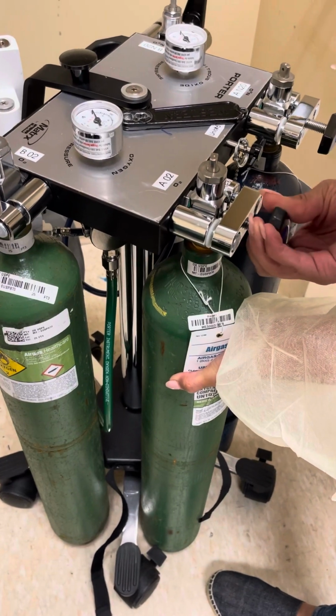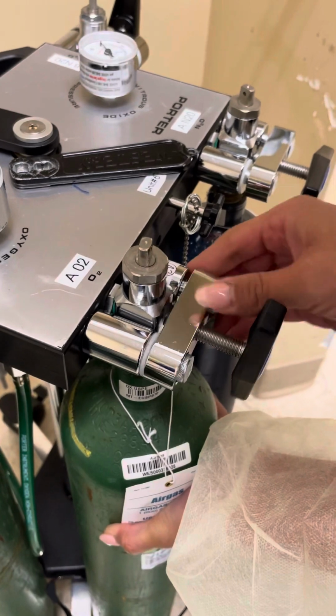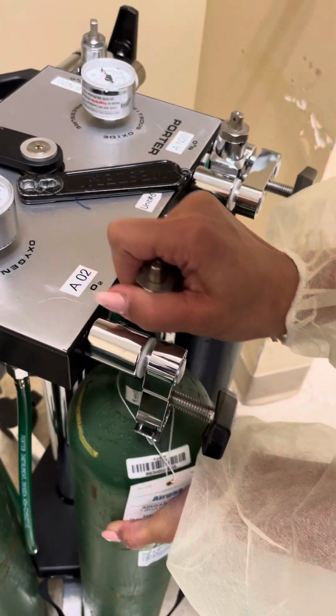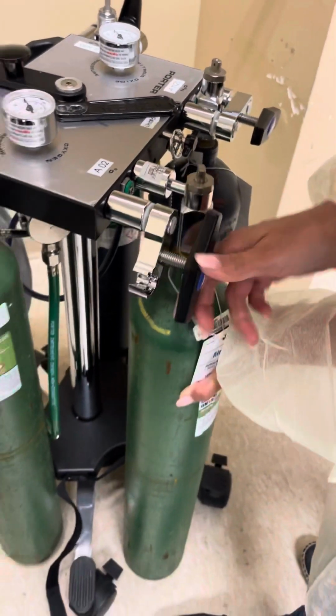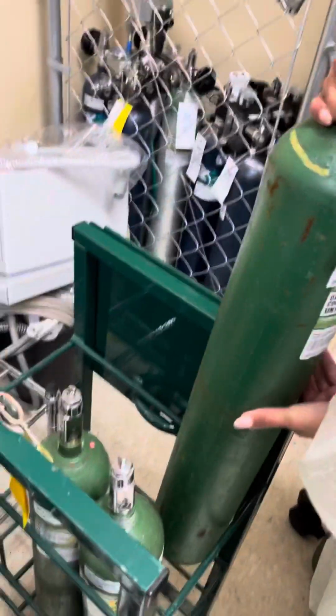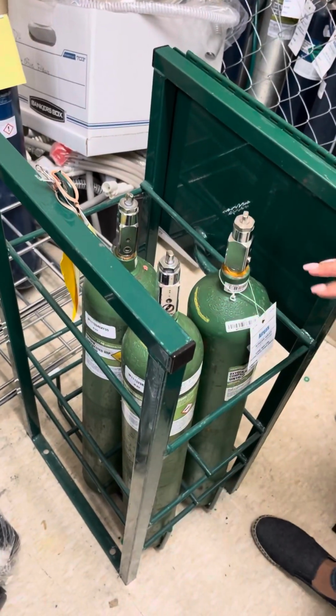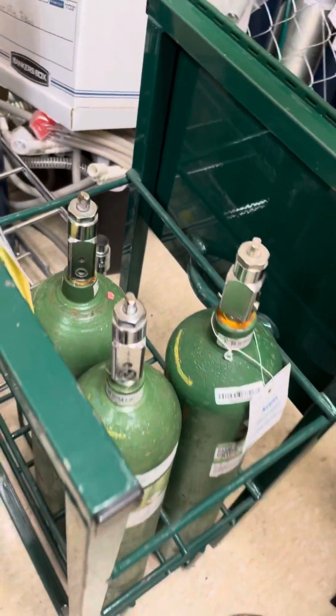You're gonna unscrew this part here, and then you're going to open the latch and you will take the tank off, okay? When you take the tank off, you're going to put it in the area where the tanks are empty, and you will see other empty tanks around, or you'll see it doesn't say full there.